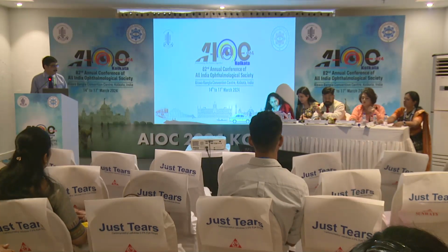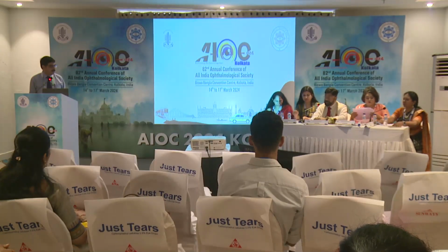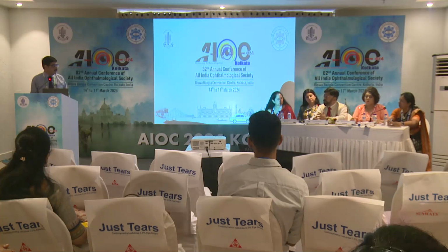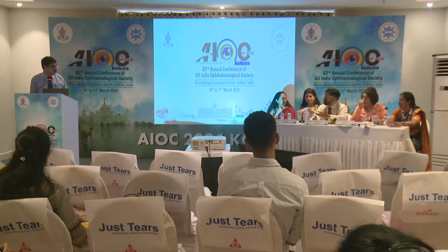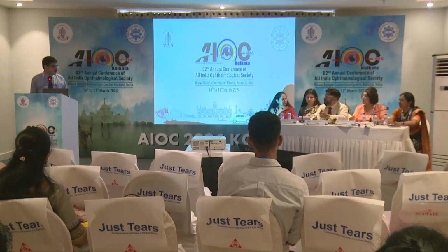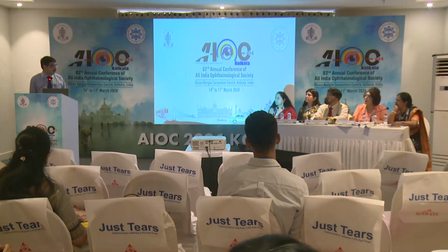Yes, sir. Very nice study. But could you please tell me why did you not choose to go for a toric IOL if it's around 1.5 astigmatism? We did above 1.5, yes, sir. Usually if it's with the rule, you take above 1.5, and if it's against the rule, then you take about 1 as the cutoff.